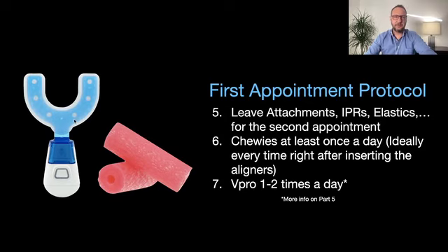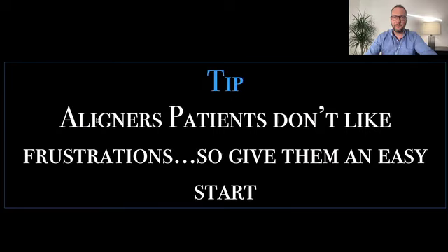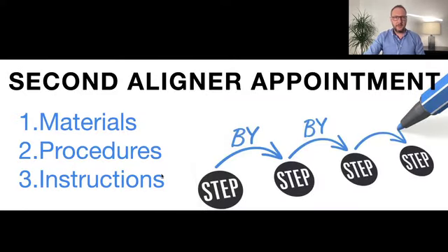But the Vipro, it's something that can increase the bone remodeling process a lot, and it needs to be used only 5 minutes a day, biting this mouth guard here, okay? So after this clinical part, and before we start talking about the protocols to bond, the first tip: aligner patients don't like frustration, so give them an easy start, okay?